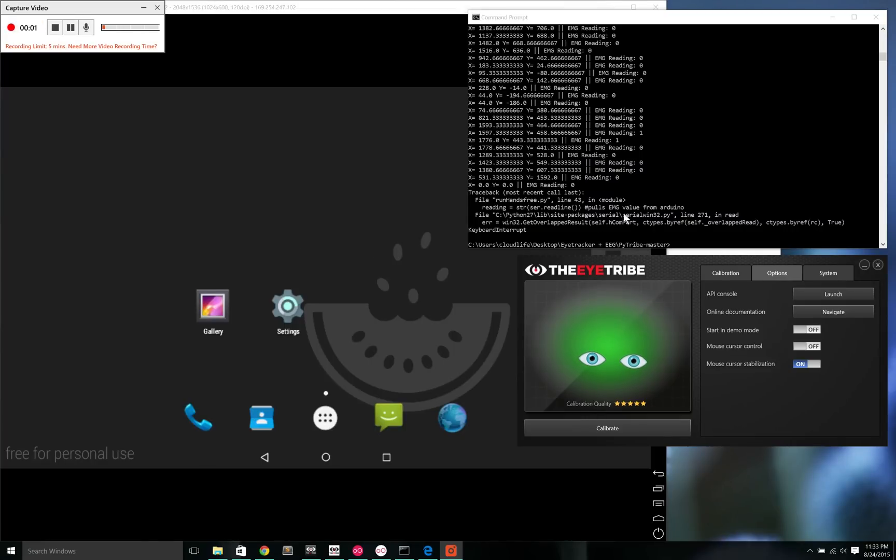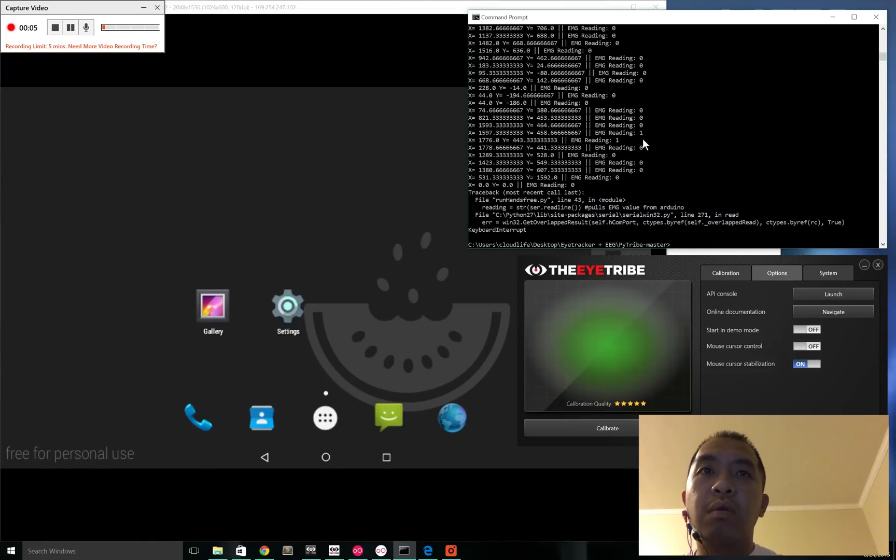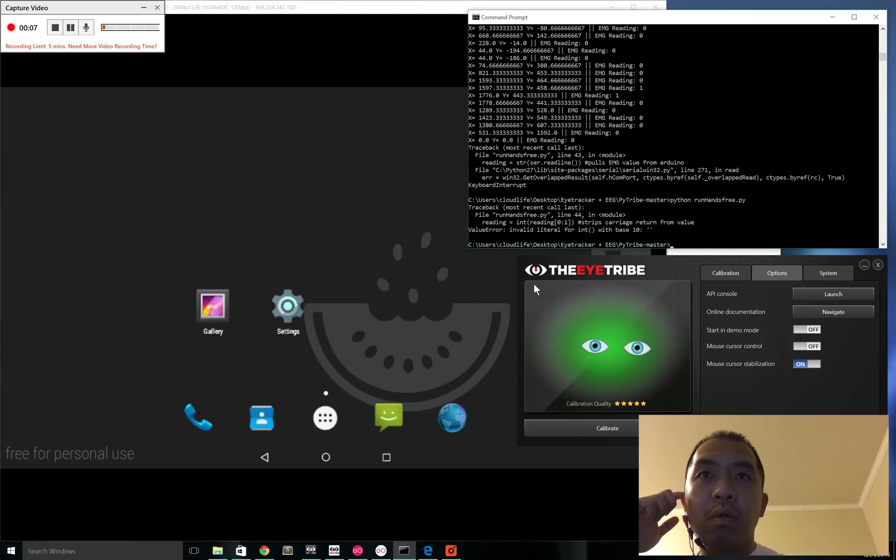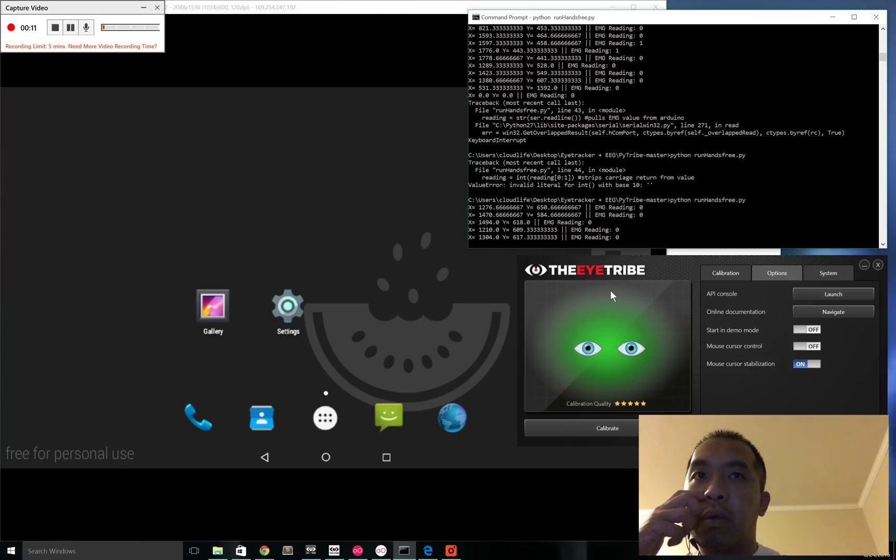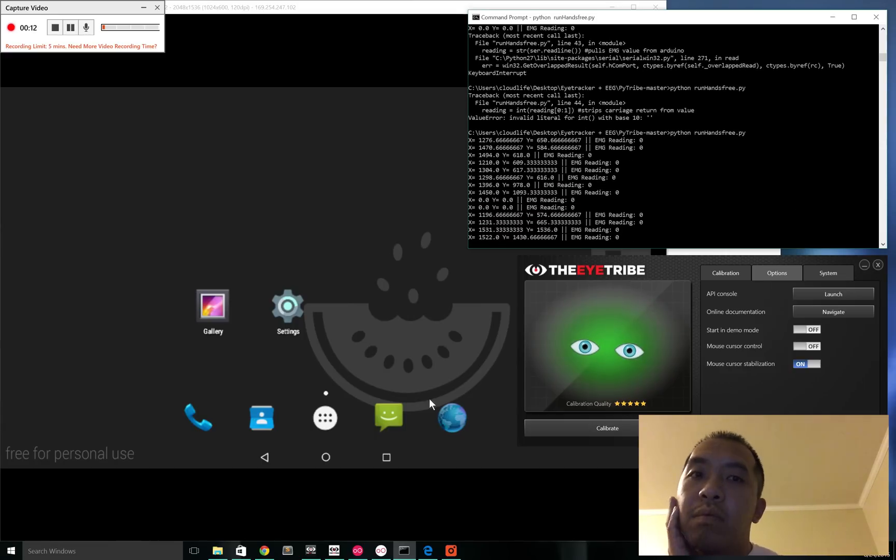Hi, this is a quick video to show how this hands-free computer interface works. It's basically a combination of an eye tracker, which provides the XY coordinates, and an EMG, which provides the clicking events.